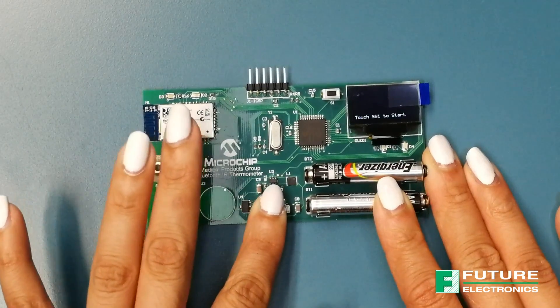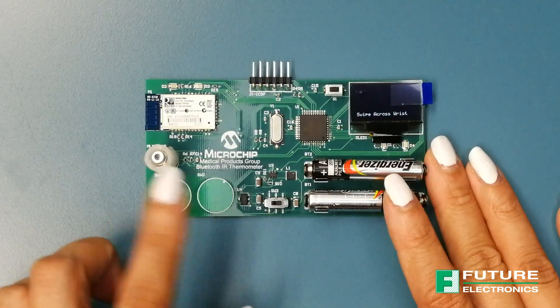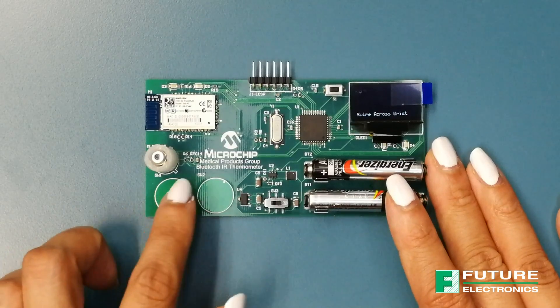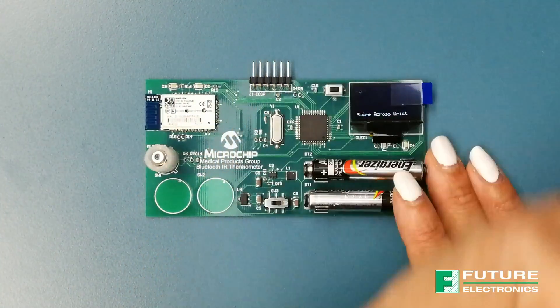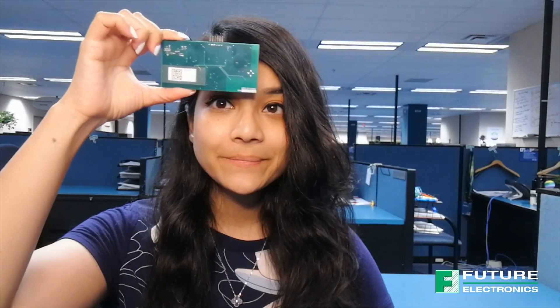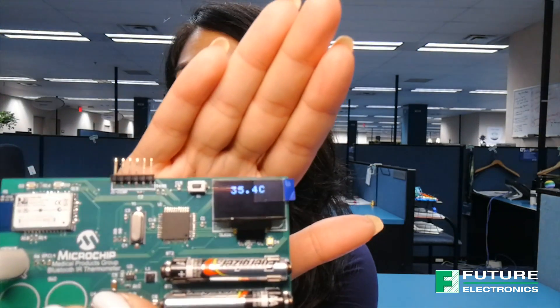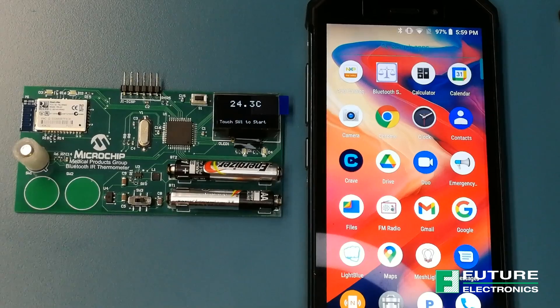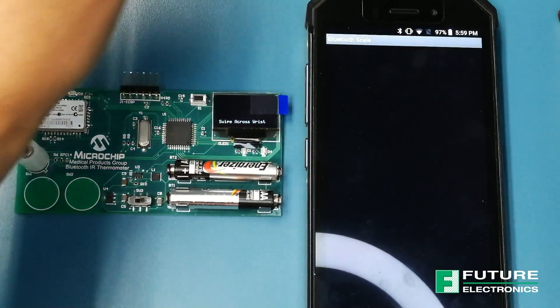So how does this board work? Turn on the switch like so. You'll be asked to touch switch one for measurements in degrees Celsius or switch two for degrees Fahrenheit. Once you've made your selection, then swipe your wrist across the sensor like so, or you can swipe it across your forehead like so. We can also use a Bluetooth smart device to connect to the board and have the results displayed over there.